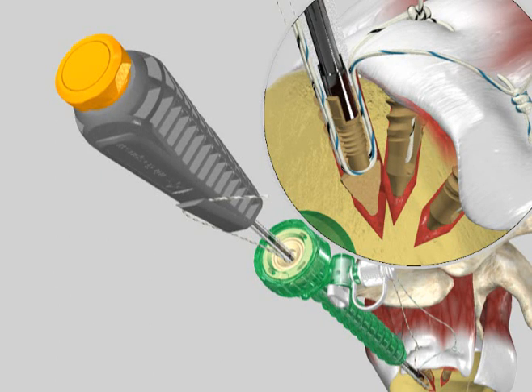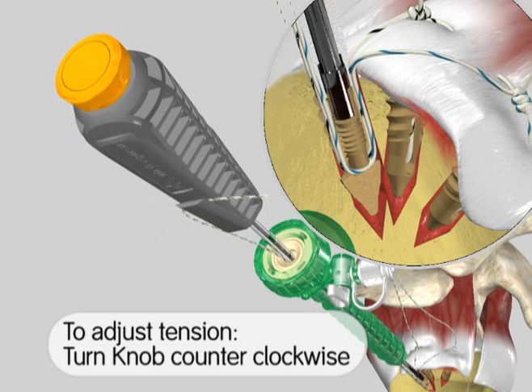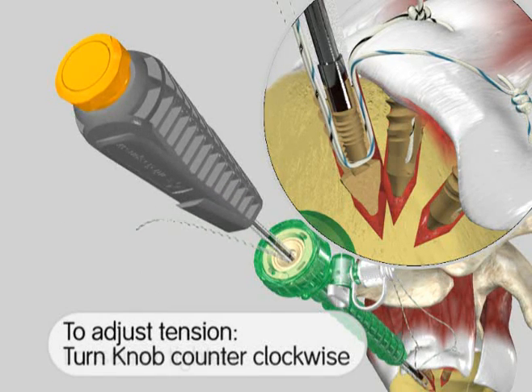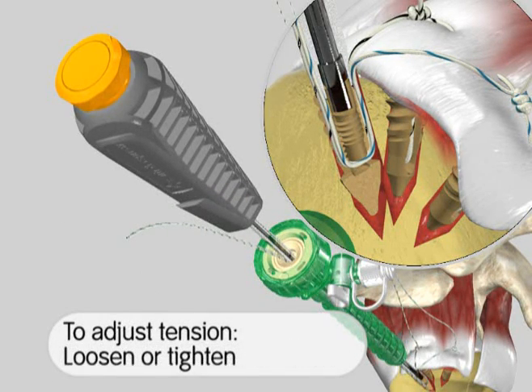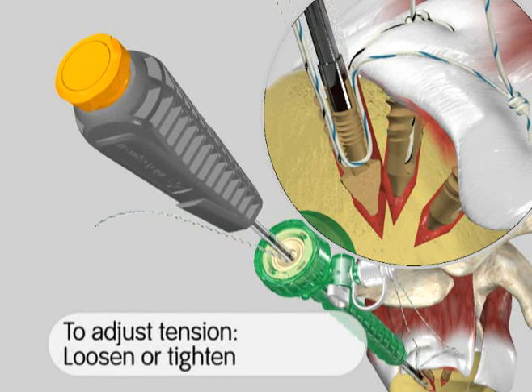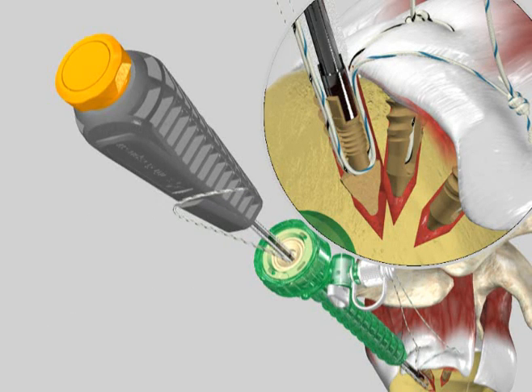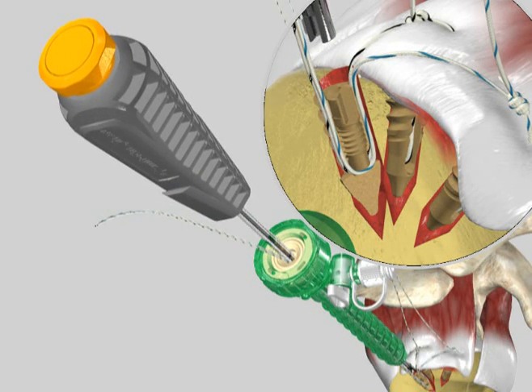Upon checking the final fixation, if an adjustment to the suture tension is warranted, hold the inserter handle and turn the torque limiter knob in a counterclockwise direction only until the suture can slide through the hole in the anchor tip. Loosen or tighten the suture until the desired amount of tension is achieved. The knob is then turned in a clockwise direction to lock the sutures into place. Remove the inserter handle and cut the suture.